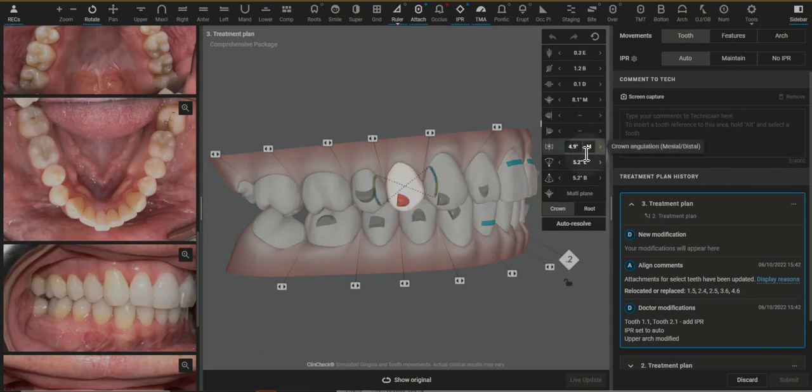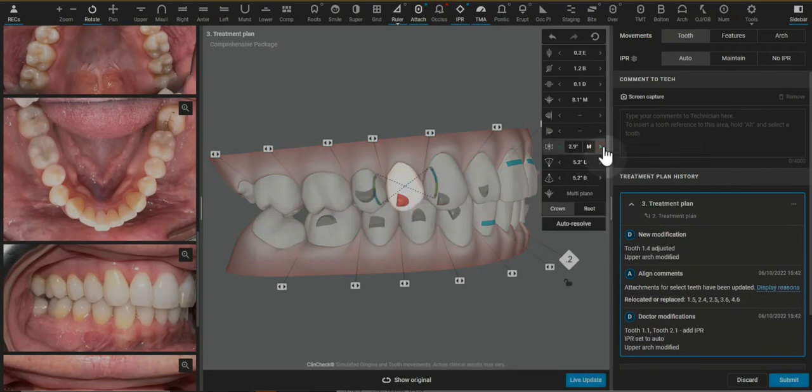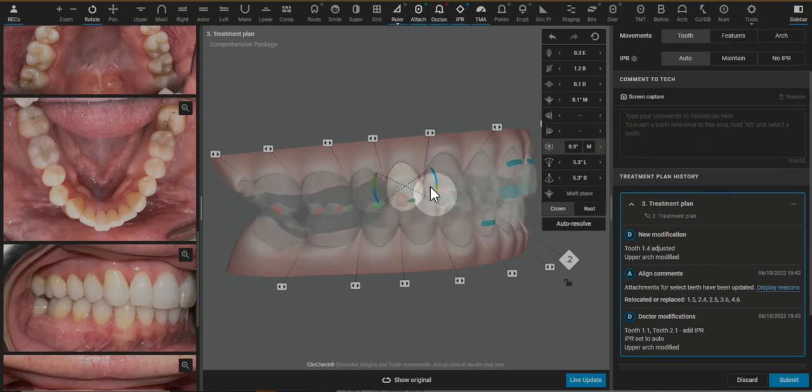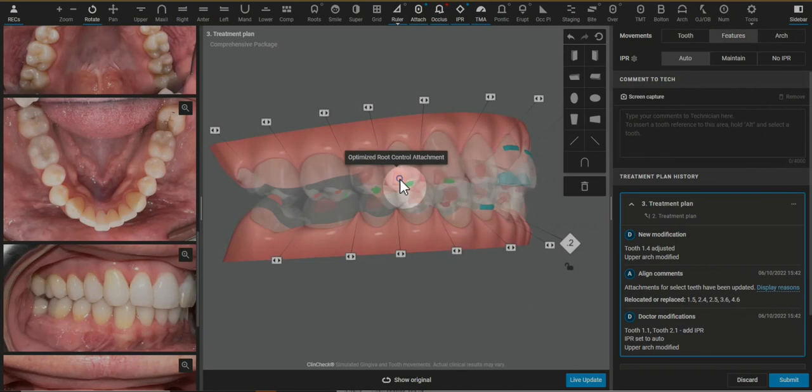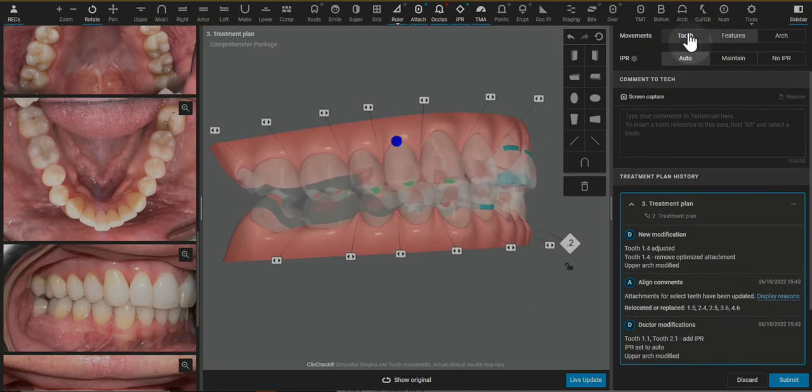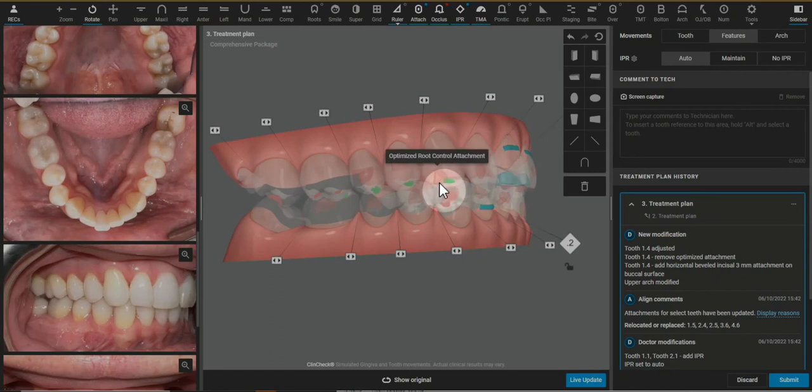This is the type of movement that is the least predictable to do and typically not very helpful for an adult just improving aesthetics and reducing and correcting a deep bite type case.